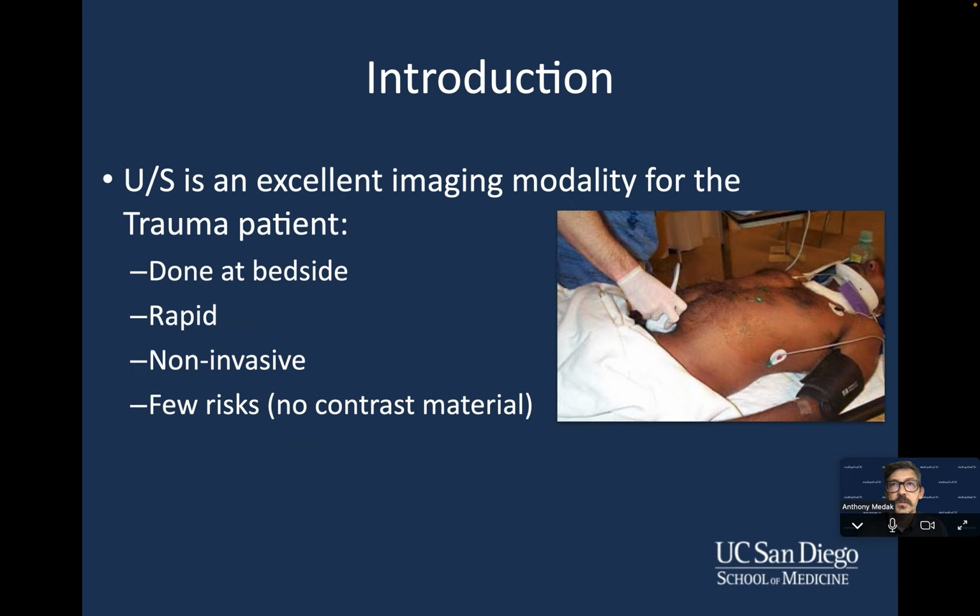So just generally at this point, as MS2s, you guys are already pretty familiar with the different ways that we can use ultrasound. Over the course of this particular class that you guys have taken, we have looked at the thyroid, we have looked at the gallbladder, we have looked at the kidneys. Today is going to be a nice session because it's going to pull a lot of those techniques and skills you used and put them all together.